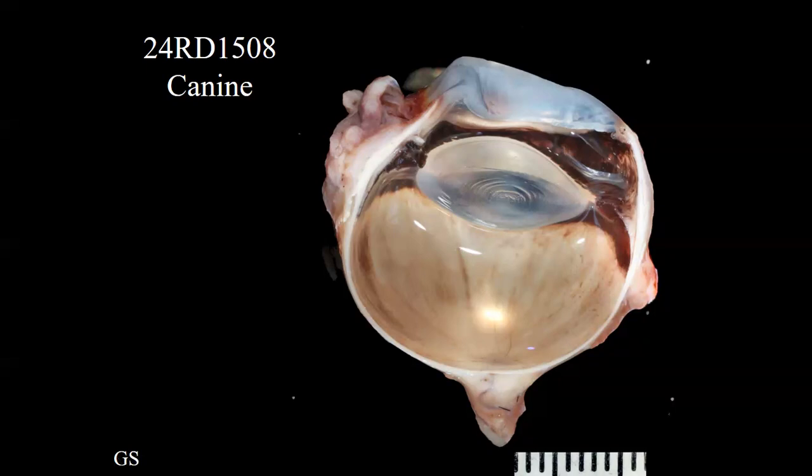So this is consistent with a blue eye. And then when we stared at this for a really long time, we decided that there in fact was an iris. So here it is right here on one side of the eye. The other side of the eye, it's a little bit harder to make out, but you can also see it sort of deeper in this hemisected globe. So it is poorly pigmented. So this is once again consistent with a blue eye. And at least on this side of the eye, you can see that there's pretty prominent ectropion uvea, where the pigmented iris epithelium is being brought around, curved around that pupillary margin. And maybe it's hard to tell what's happening on the front of the iris right here. But anyway, so we found the iris. It's not what you think.